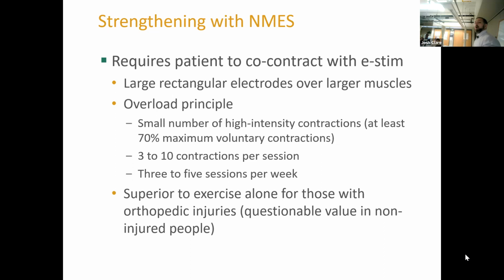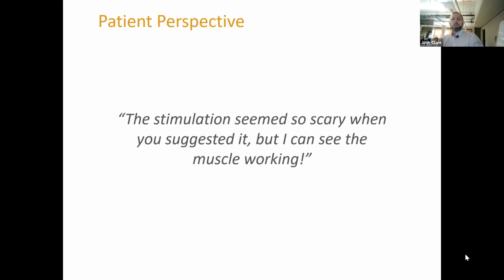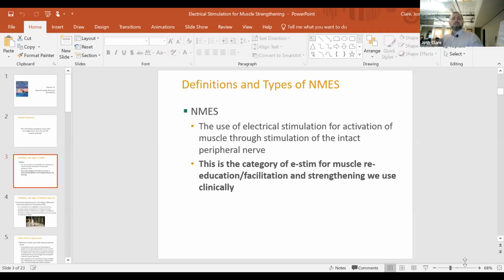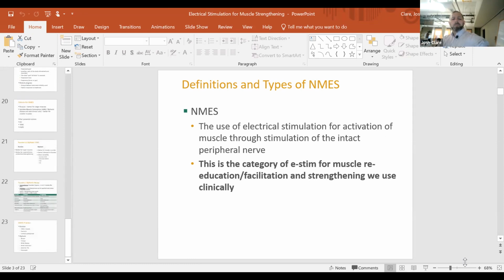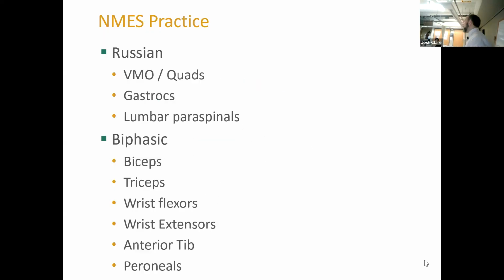All right, so I've got some locations I want us to try. For Russian, I want us to try quads, and specifically I want both quads, but I also want to see if you can get specifically to the VMO. Gastrocs, lumbar paraspinals. For the biphasic, biceps, triceps, wrist flexors, extensors, anterior tib, peroneal. See if we can get all those areas. Okay, so lots of practice. All right, let's have some fun.